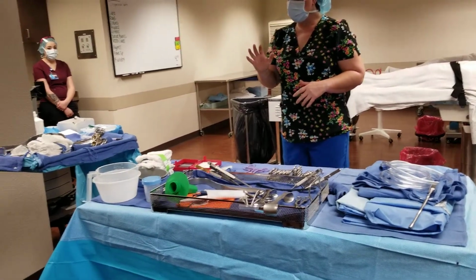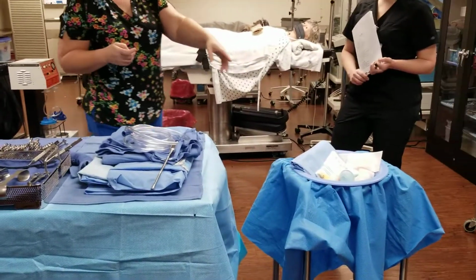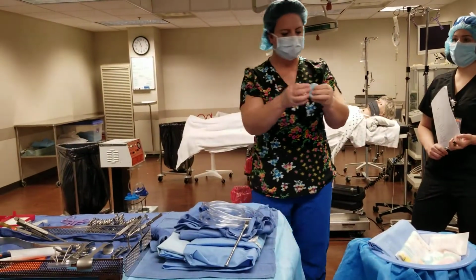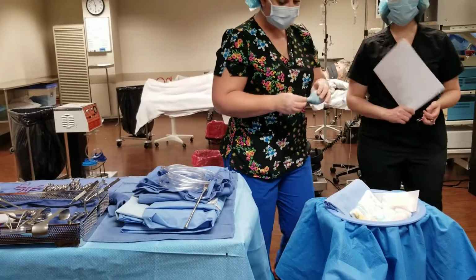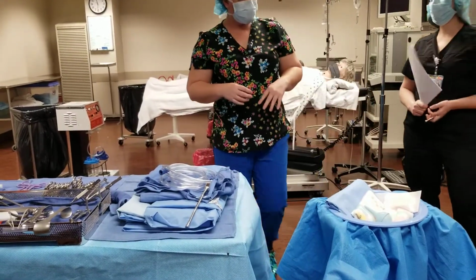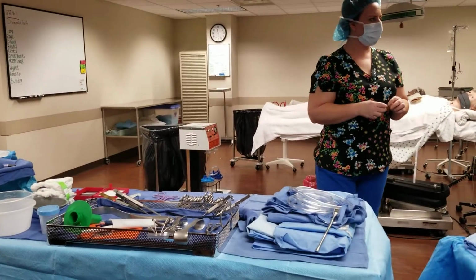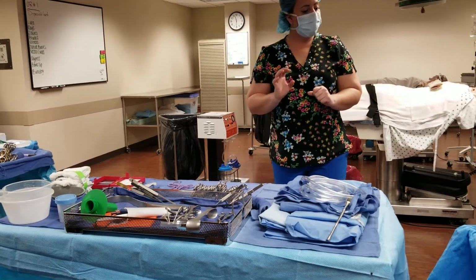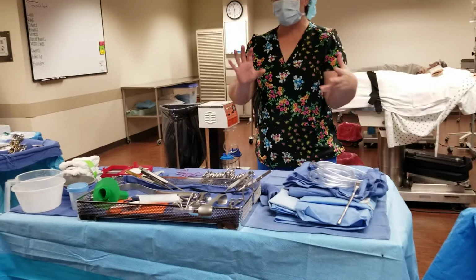Once they're ready to get baby out, get your blankie and your booger sucker, the little baby bulb syringe. Blankie and bulb syringe. Did I miss anything yet? Then one C-section, one emergency, a real emergency, just slash and dash. So get your blanket, get your sucker. They're going to get baby out.